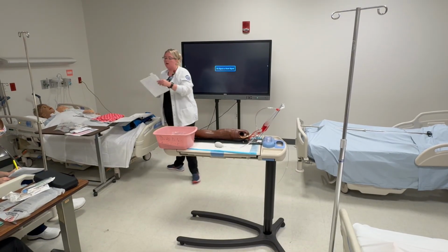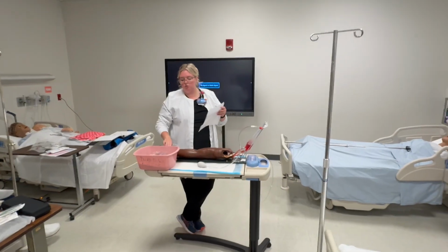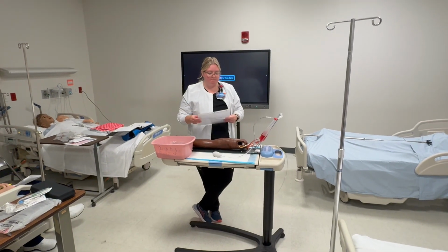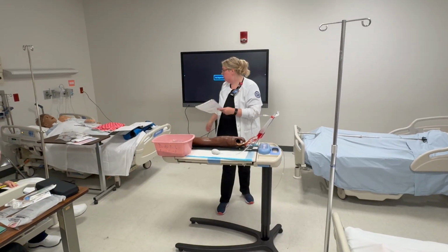So this is an example of what the order sheet will look like. I have my right patient, John Smith. You aren't at your patient's bedside for this first check. So you're going to look at your right patient. I've got my right patient, John Smith. I've got my right medication.